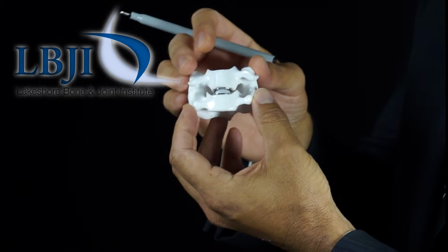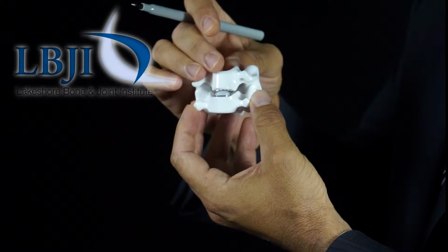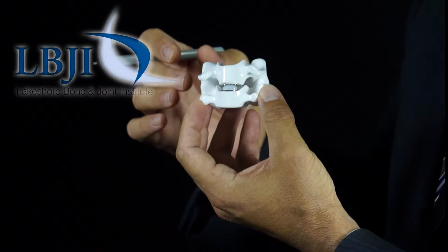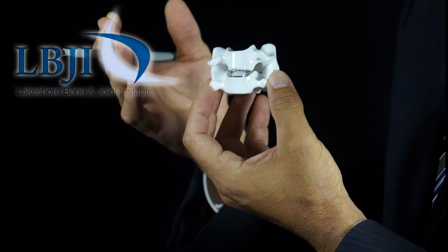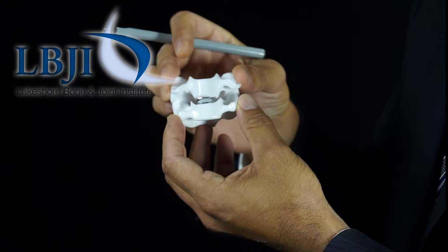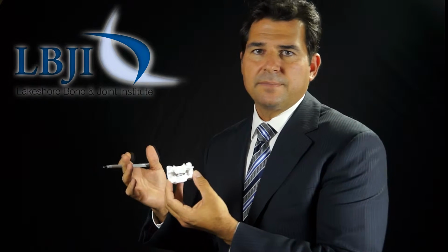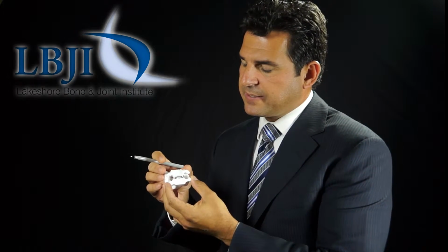The benefit of using an artificial disc is it doesn't put more responsibility on the disc above and below the surgical site, such as that we encounter after a fusion. The artificial disc allows us motion in lateral bending, flexion, extension, as well as rotation, which maintains very similar mechanics to the normal cervical spine and disc.